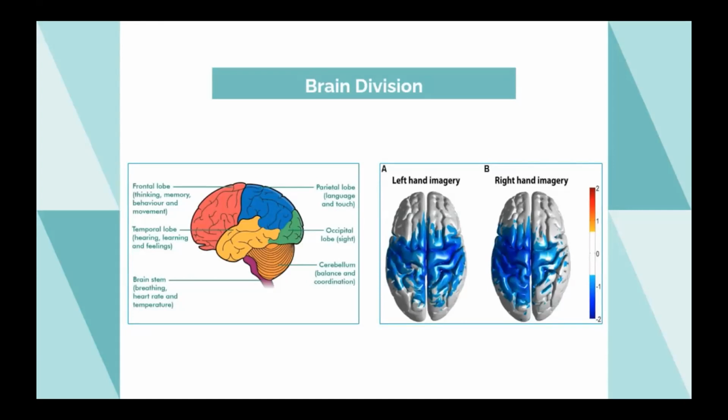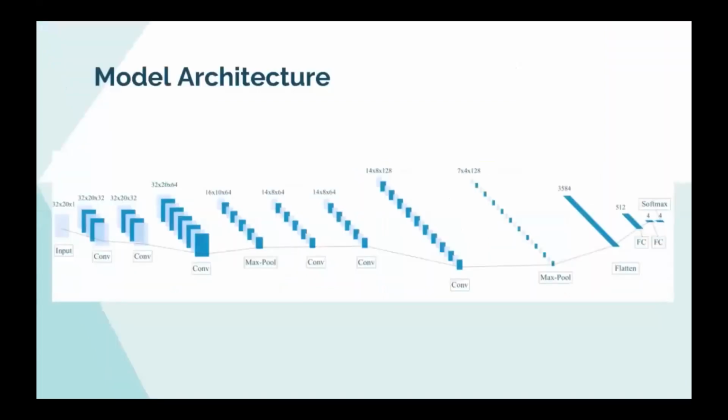Scouting is the process of picking electrodes that are located in a specific part of the brain. Scouting helped us identify which electrodes held the information we needed to train our models. The image to the right shows an example of the part of the brain that is active during motor imagery tasks.